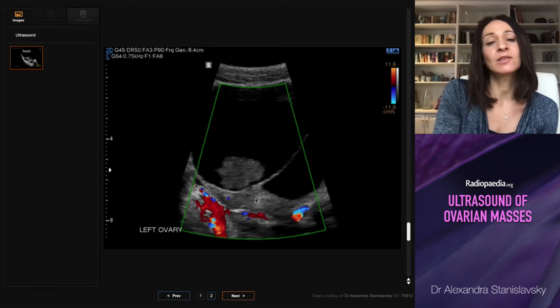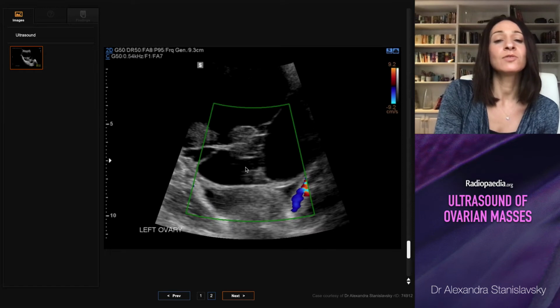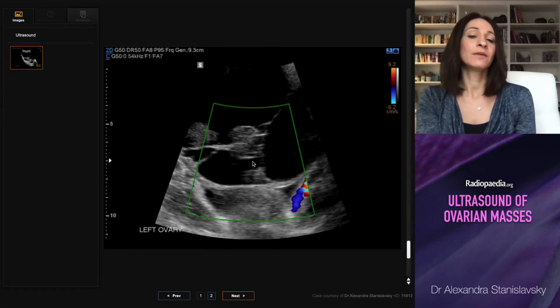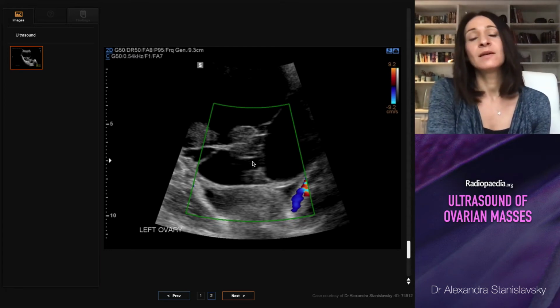It doesn't have any internal vascularity. It's got sharp margins around it, at least on this view. But some of them certainly do seem quite well placed on the septa. So even though they're not vascular, these are certainly solid components. So multilocular solid tumour without much internal vascularity in a 12-year-old girl. So this is really hard. I mean, there's no way we can tell what it is.